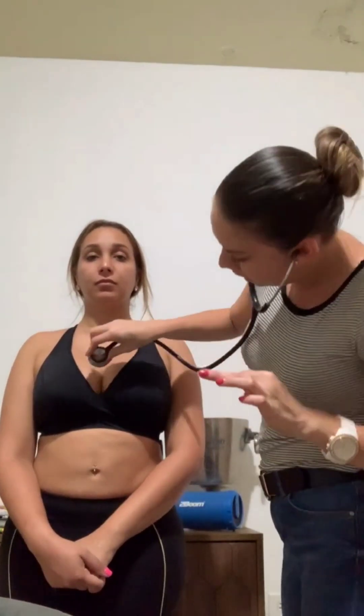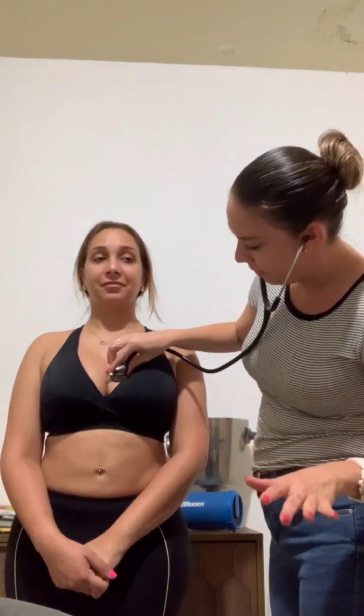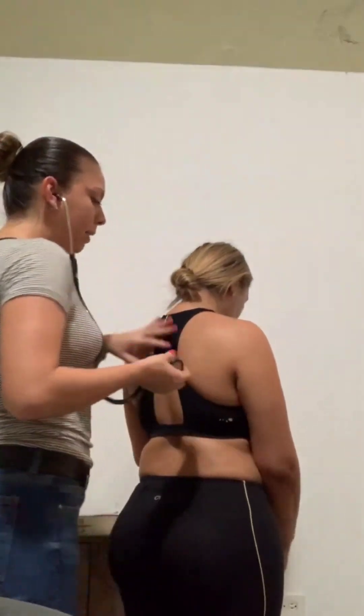After the second intercostal, you work your way down to the fourth intercostal — keep breathing in and out. Then the last parts you're going to auscultate are going to be right under the axillary, a little bit to the side. I'm going to proceed to turn her towards her back again and do the same thing on this side.